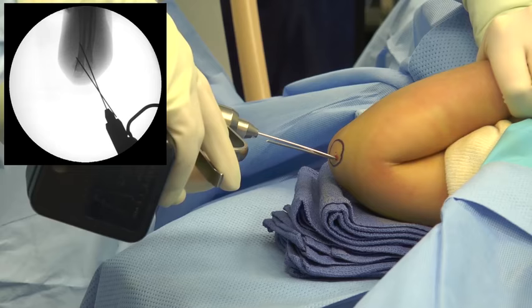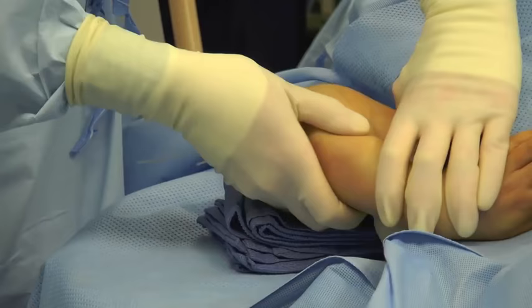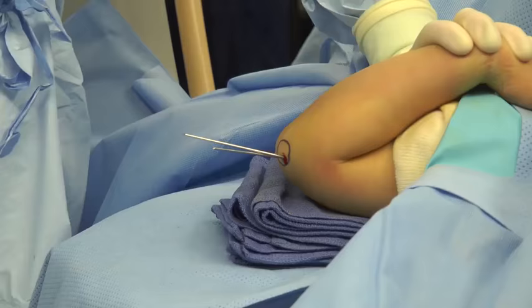A second pin is then also placed, and again fluoroscopic confirmation is performed in the anterior-posterior as well as the lateral position. Once two pins have been placed, stability can be checked.